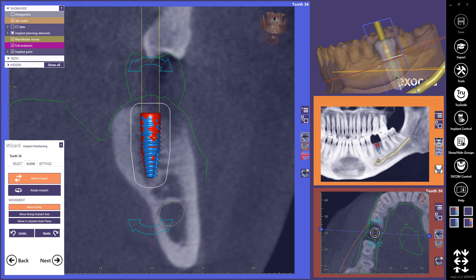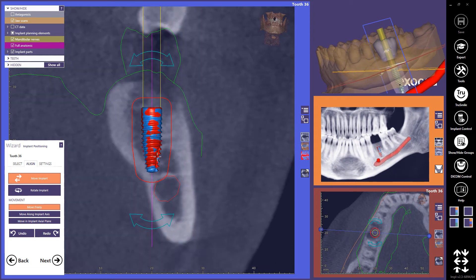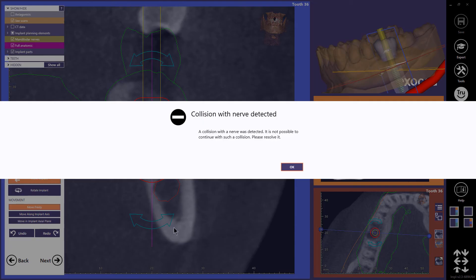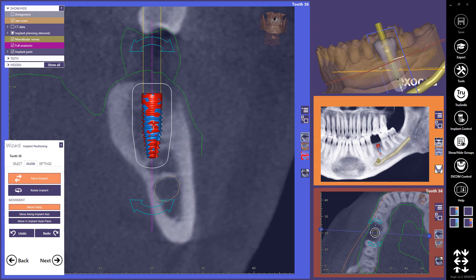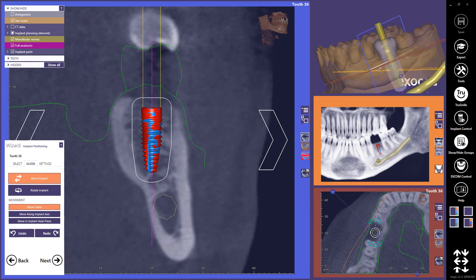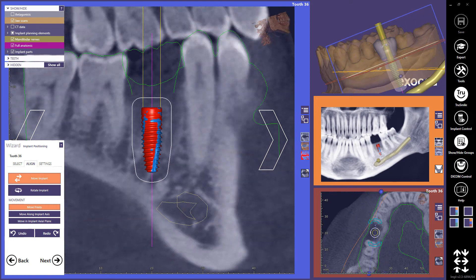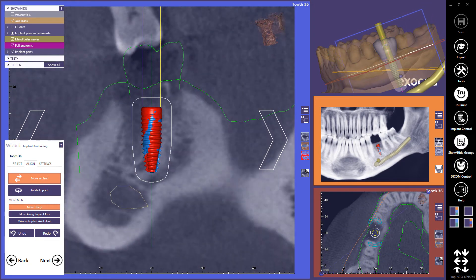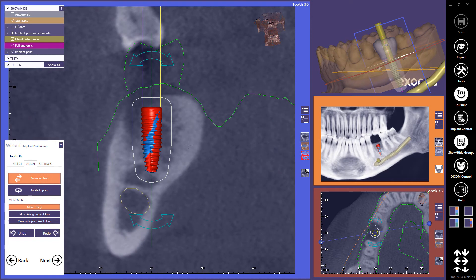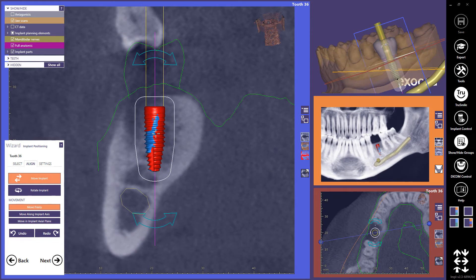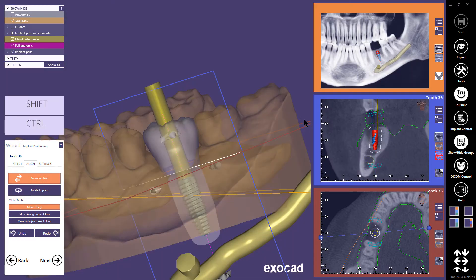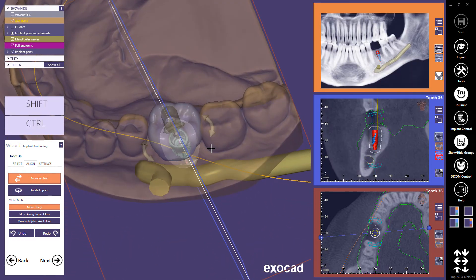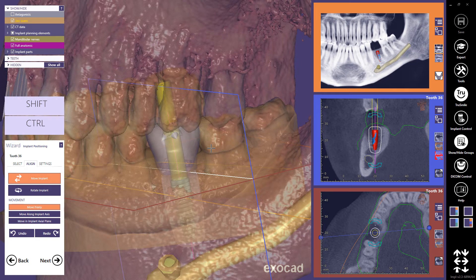If I place my implant too close to the nerve canal I marked in a previous step, a collision warning is shown when I try to proceed with Next. I must fix that situation before I can continue. To rotate the secondary view around the implant, keep the right mouse button pressed and move the mouse. Exoplan does not verify if you have placed an implant at an eligible position for the selected tooth number. When I am happy with the placement, I continue to the sleeve placement step.